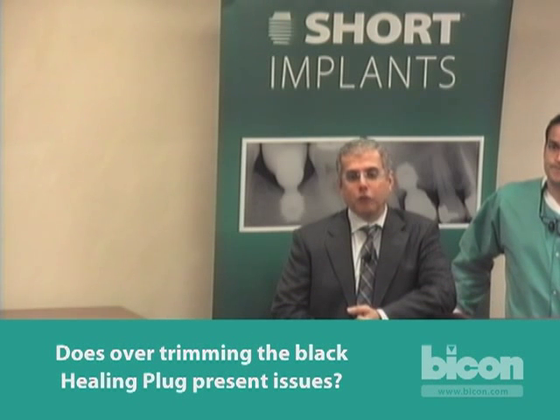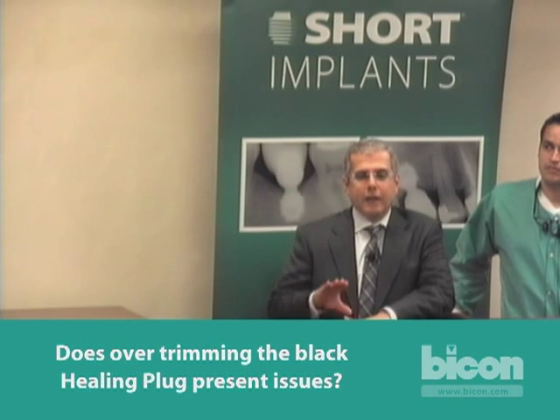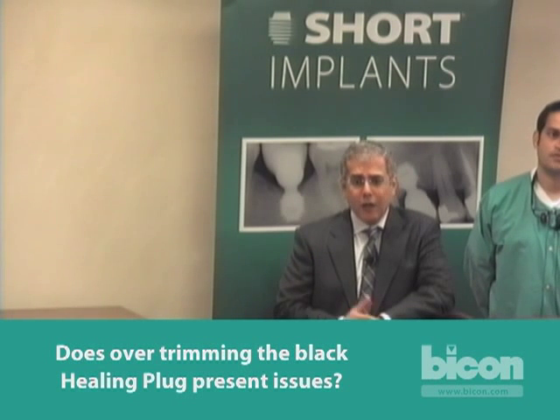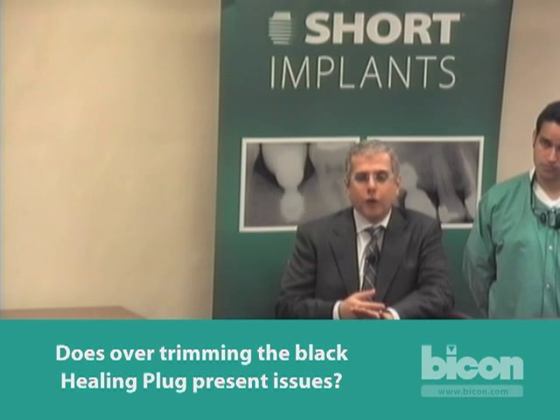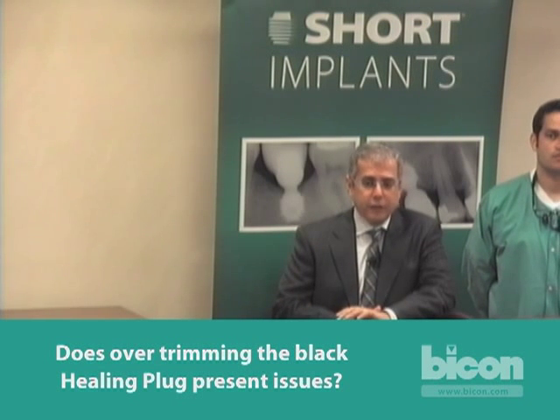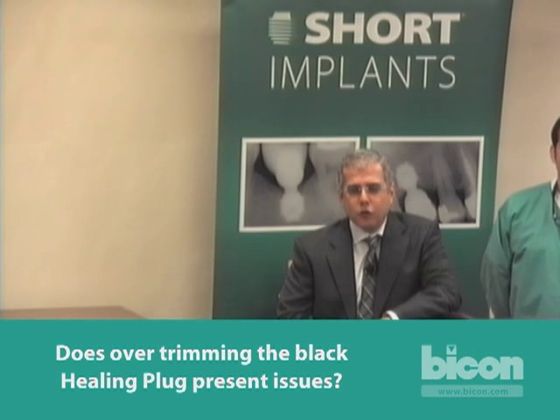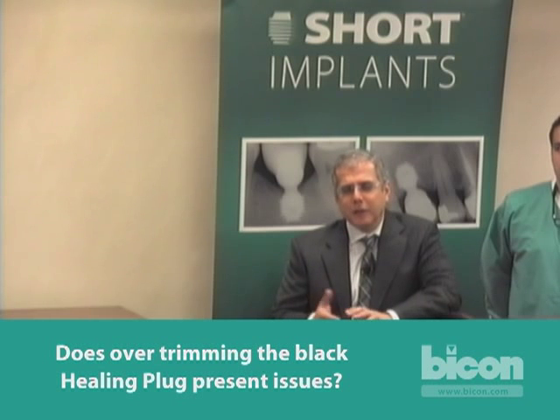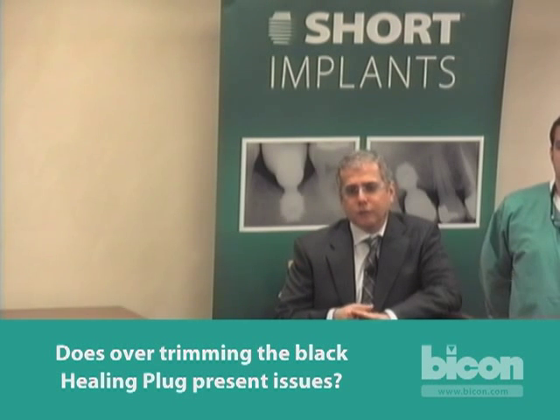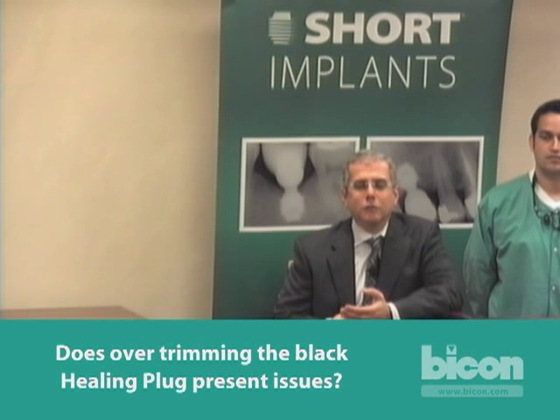I actually over-trim the healing plug on purpose most of the time. I would much rather have the black plug be just slightly within the confines of the crest of the bone. It is then less likely to allow for permucosal loading of the implant, or in case of thin mucosa to cause it to wear through too early in an inopportune spot that would deprive the implant from attached gingiva as we uncover it. So if I were using the black plug, I want it to be spot on or shorter than the crest of the bone. Over-trimming it so much that it's lost inside the well is not going to help, as it will make uncovering that implant extremely risky. Keep it above the implant and preferably right at or ever so slightly below the bone.